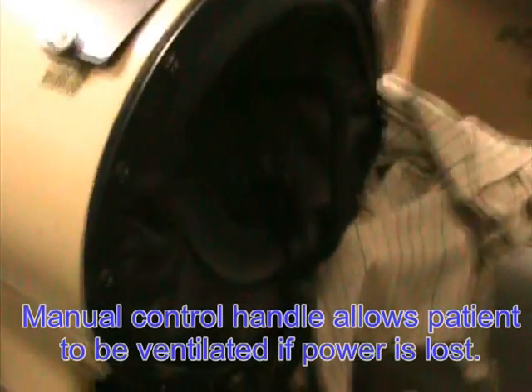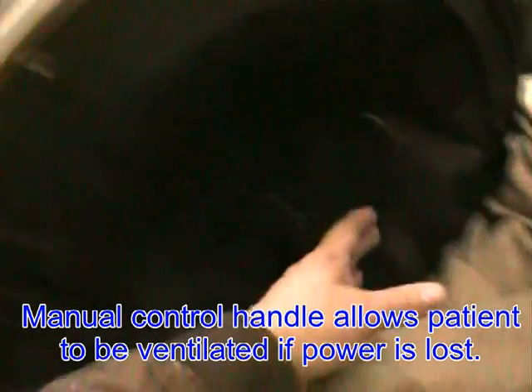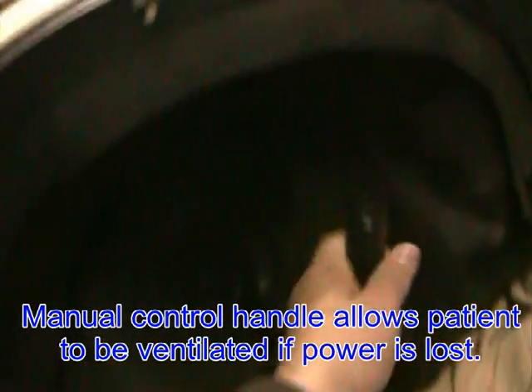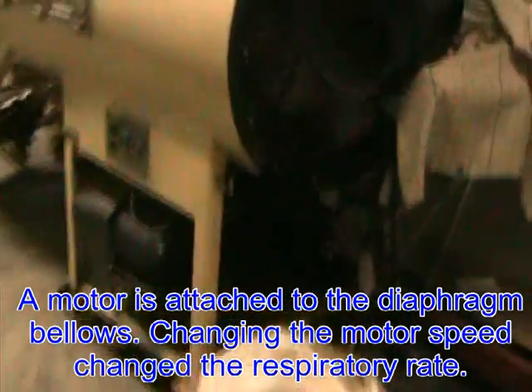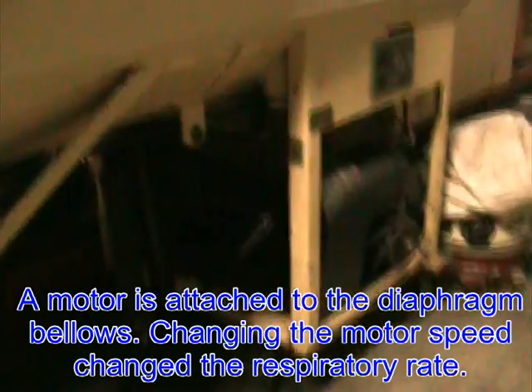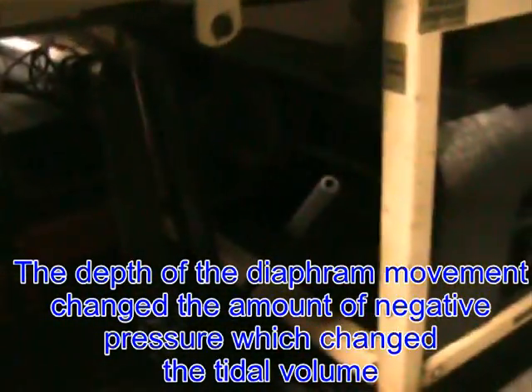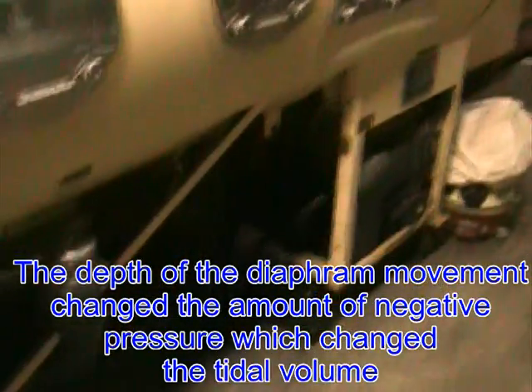On the back side we have the manual handle to ventilate — this is pulled back and forth to create a vacuum for the patient. Underneath we have the motor, and the rate is adjusted by the speed of the motor, and the amount of vacuum is adjusted by the depth of the bellows being moved.